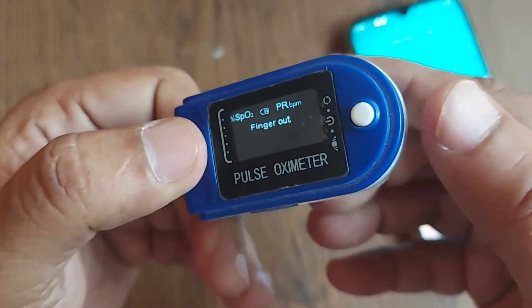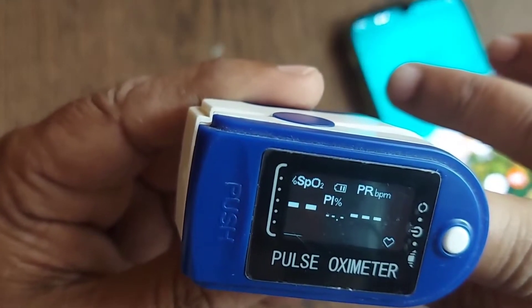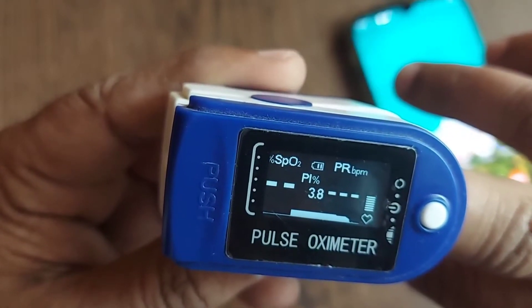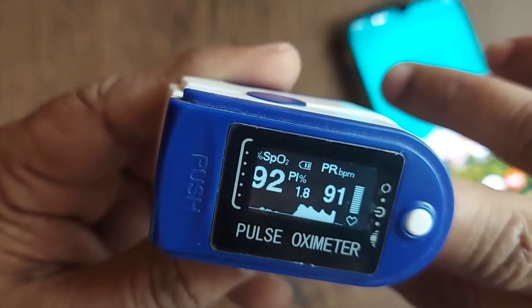I have to just push this and place my middle finger here. The reading will be shown here — it's measuring. Basically, it measures two parameters: one is SpO2 and one is PR.